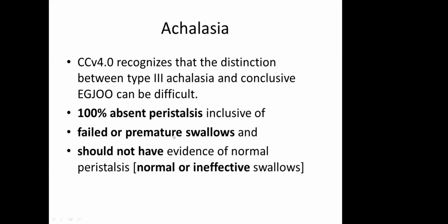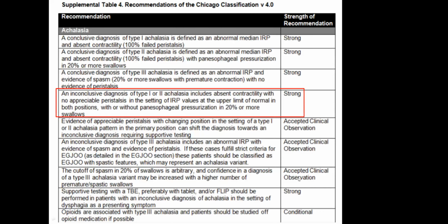They have included that inside the protocol. So for achalasia, I think the definition remains the same. There's nothing changed: 100% absent peristalsis, failed or premature swallows, premature for type 3, and also should not have evidence of normal peristalsis. So this is the recommendation for achalasia.